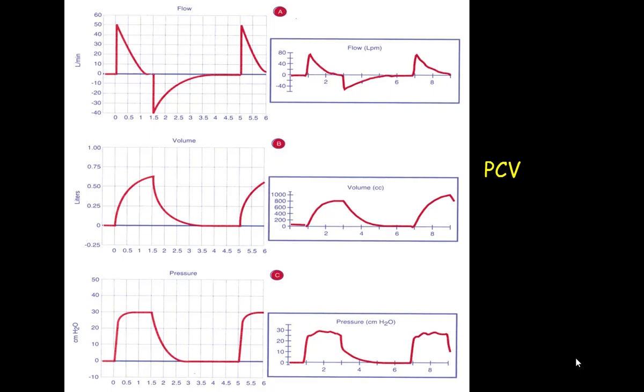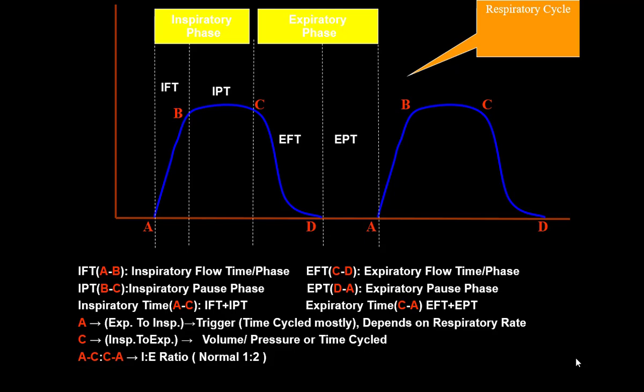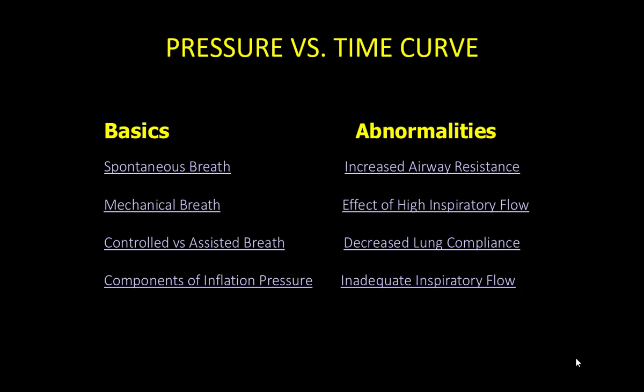The expiratory phase is always passive, it's going to be the same for both volume and pressure. The pressure is fixed, obviously. So, this is absolutely basic, so let's not just dwell on this, there's a lot more to cover.